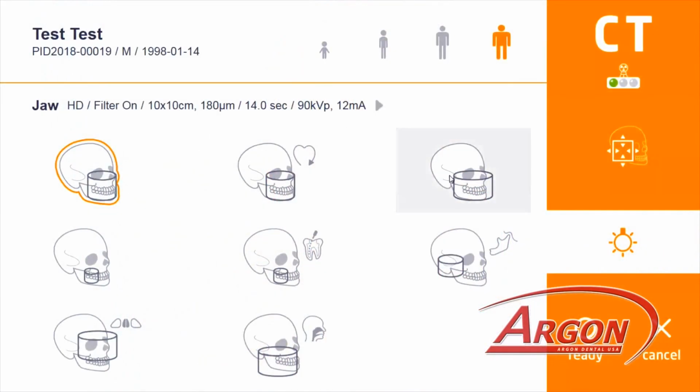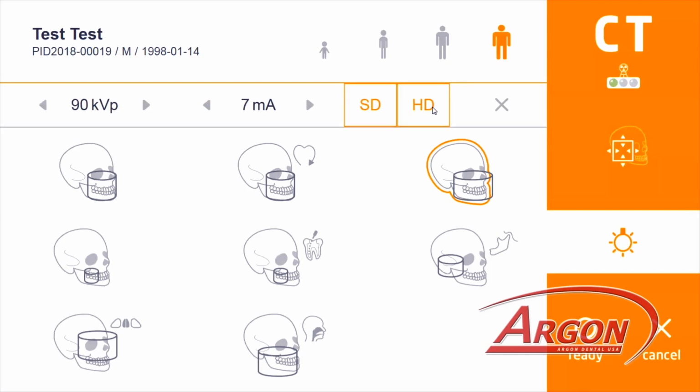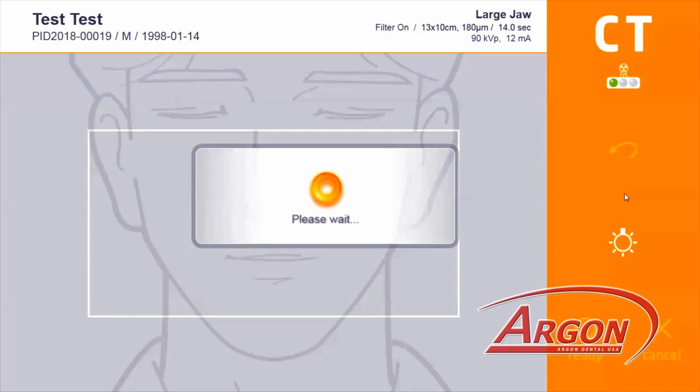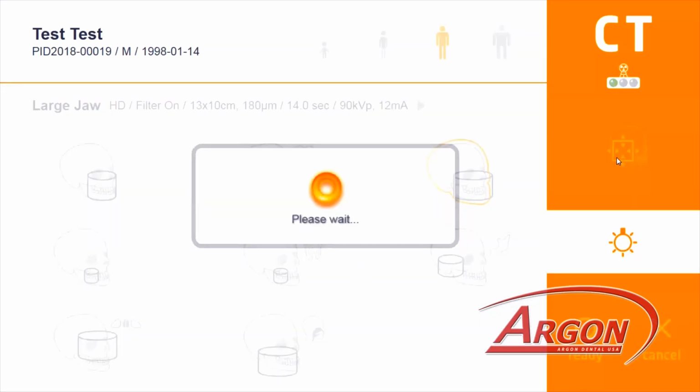You can see the blue light on the patient's left that would size it accordingly. This is a nice visual reference to see the point of interest where the CT scan is going to be performed. In this situation, we are going to maximize the field of view to a 13 by 10 CT scan. At the top, you can see different patient sizes. This is a medium build patient. The neat thing about the Alpha Plus 130, it has a field of view down to a 4x3. You can put it in a high definition CT scan.